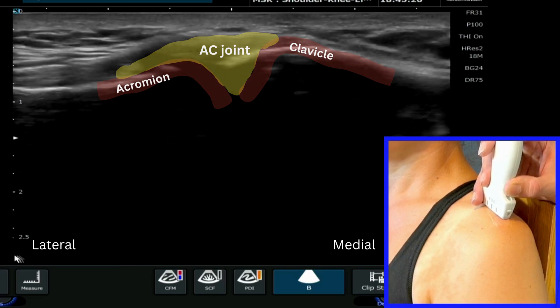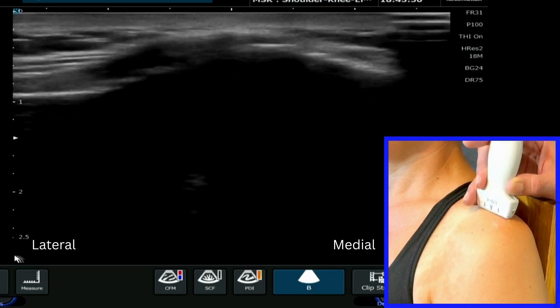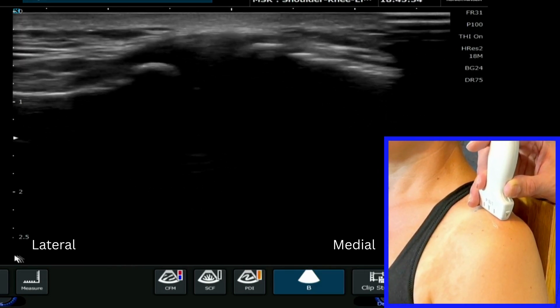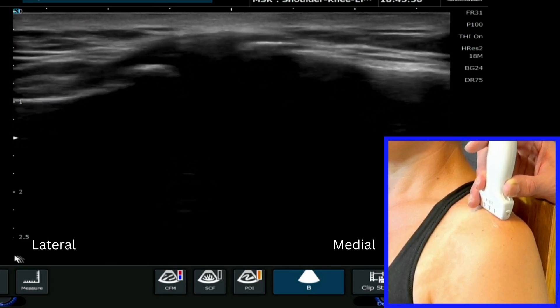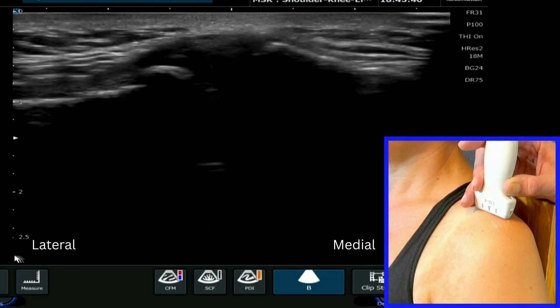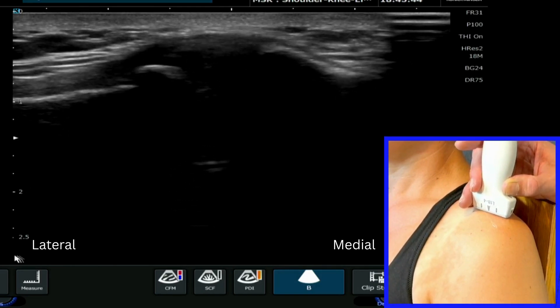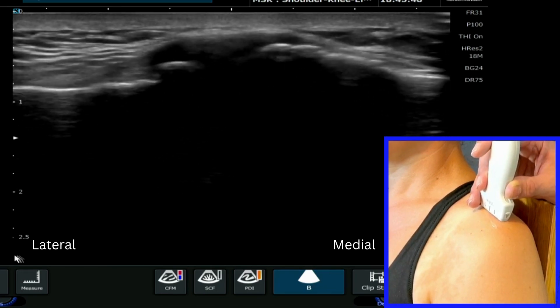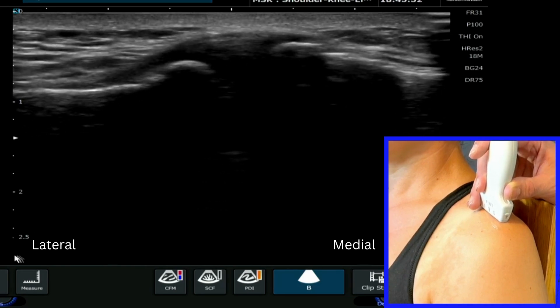It's quite a tricky area to scan because you can just drop or slip off. You also want to make sure that you're totally parallel to the structure, ensuring that you are not drifting your probe to one side of the screen, which will quite significantly change your image. You want to be totally on top of that joint, seeing the margins of the joint very clearly, and the bones should be nice and bright.